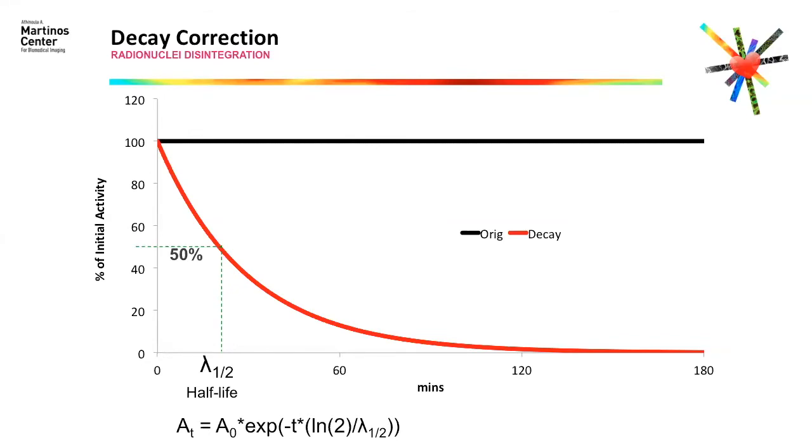radiotracer. So what is changing from an F18 radiotracer to a carbon-11 radiotracer to an oxygen-15 radiotracer is that this half-life is going to be very different. So F18 has a half-life of 2 hours. So basically, the activity of the tracer will be half by 2 hours. A carbon-11 will be 20 minutes, which is basically this curve in here. For oxygen-15, the half-life is 2 minutes. But copper-64, for instance, can be up to 12 hours. And there are other tracers with even larger half-lives.